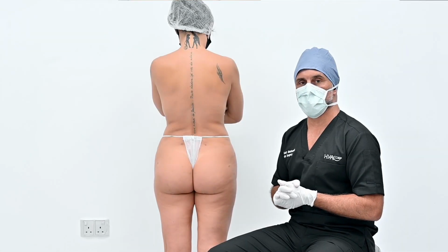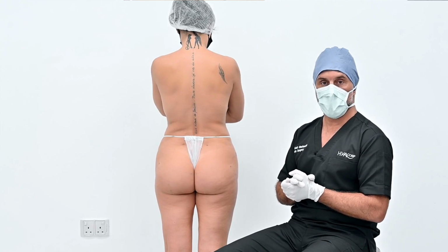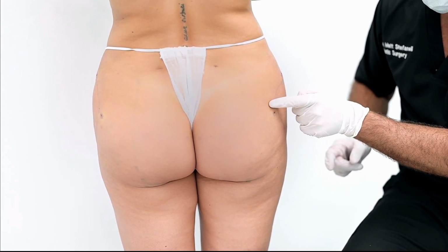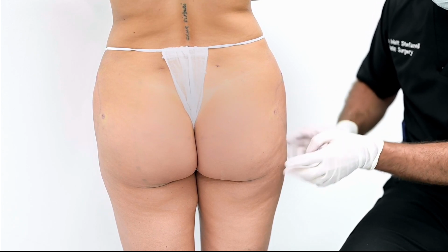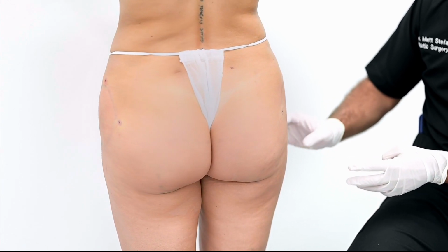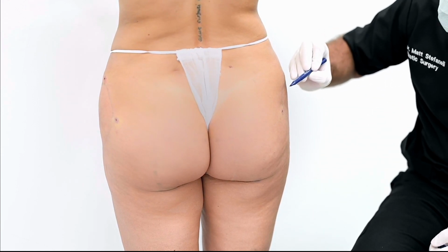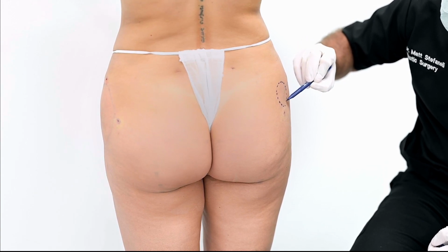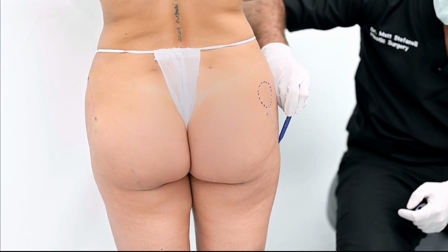So we just ask the patient to stand up for the final touch-up. Why? Because we are able to see much better. Actually, if you look, for example, on the right side, we are able to see that just in between the two entry points, there is a little flatness. And also here, below our injection, some depression. So these are transition zones, and I would like to complete a little bit the treatment in these two zones. So one will be here, and one will be here.